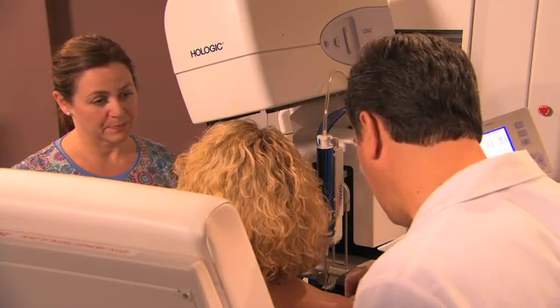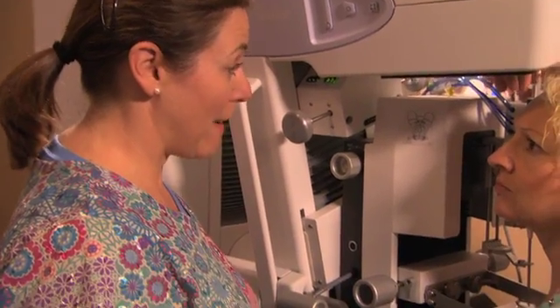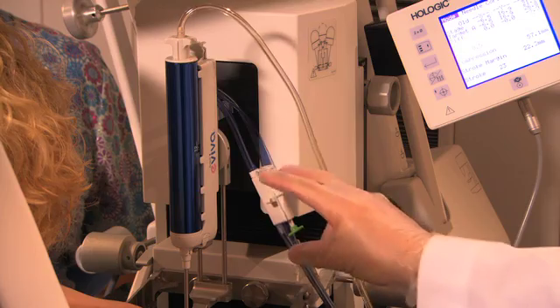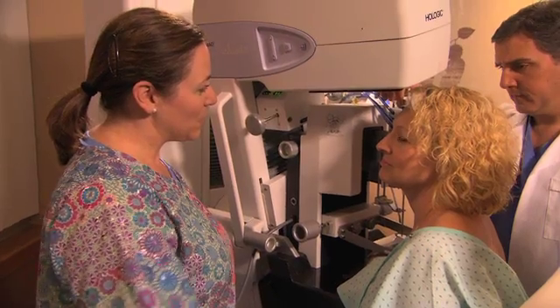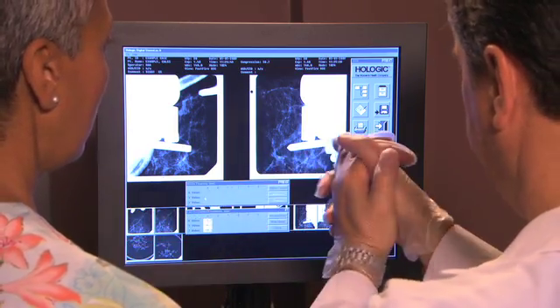Next, they will clean and numb your breast prior to making a small incision. This is the time when it's important to hold very still. Because when the instrument is triggered, you'll hear a noise and you may feel some pressure. This advances the tip of the needle into your tissue, to the exact point where they want to take a sample.